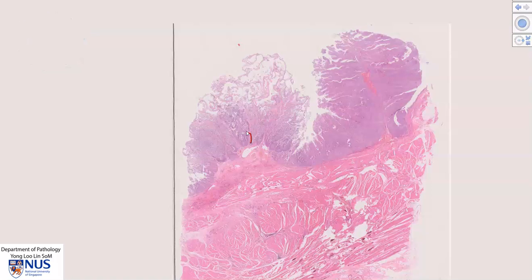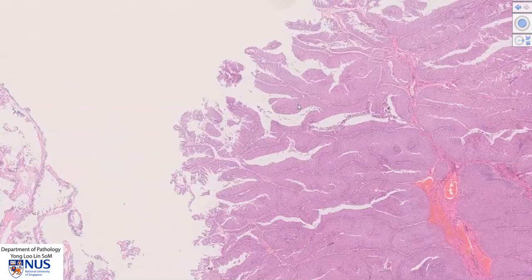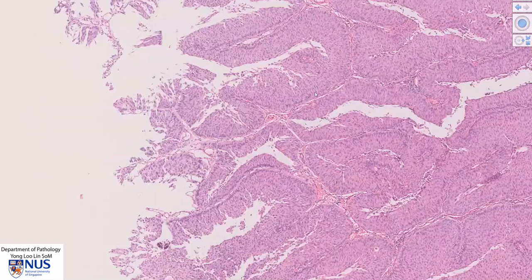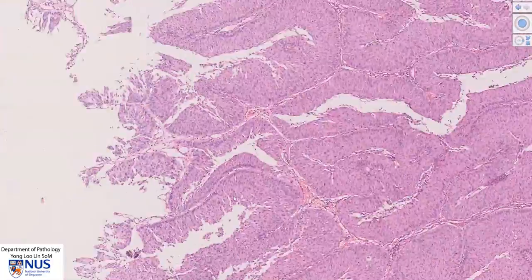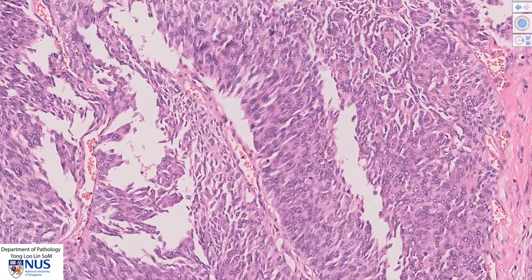In summary, this is an example of papillary urothelial carcinoma, high grade, of the urinary bladder. We can see that there is no invasion of this tumor into the underlying lamina propria or the muscle layer of the bladder. This tumor is composed of papillary finger-like fronds with delicate fibrovascular cores lined by malignant urothelial cells. There is a variable degree of architectural and nuclear atypia — less marked in some areas, but in other areas there is more disorganized architecture, higher NC ratios, and more frequent mitotic figures.